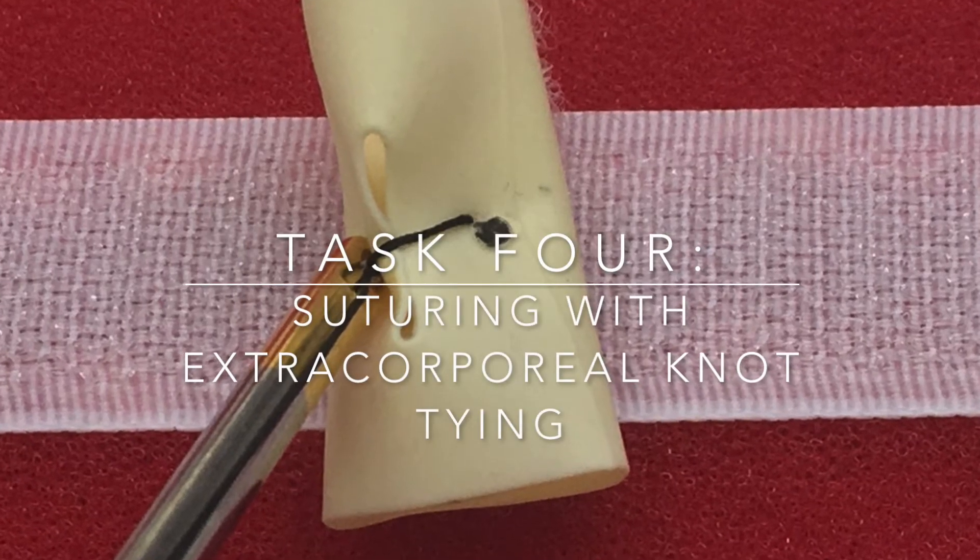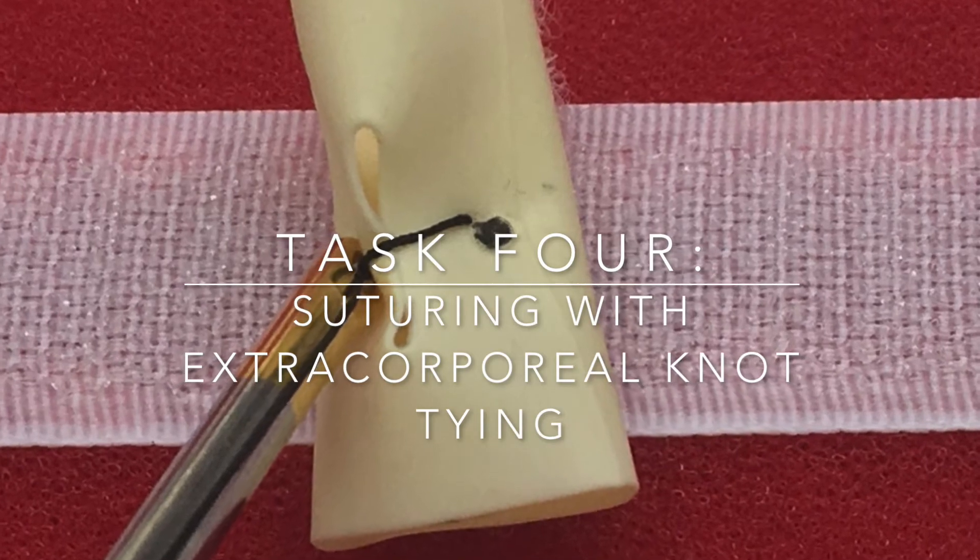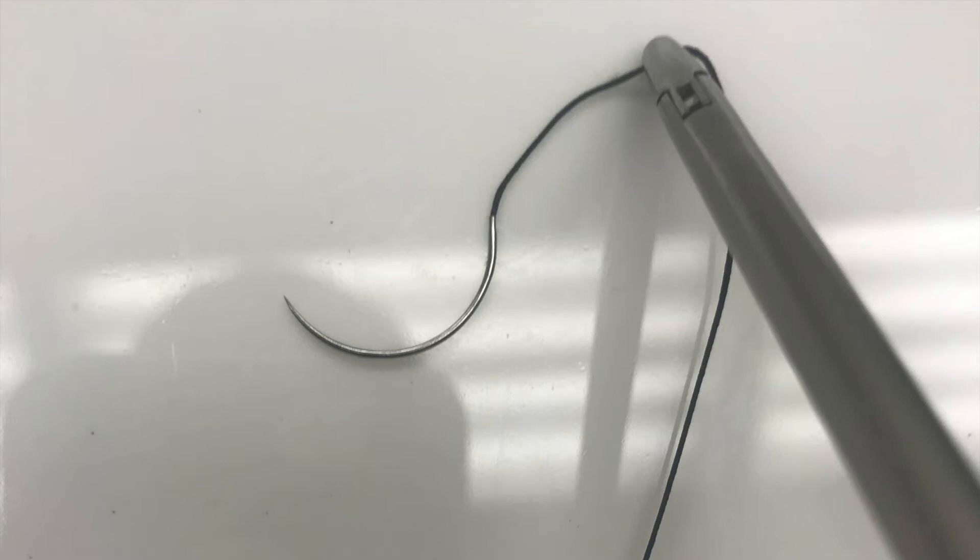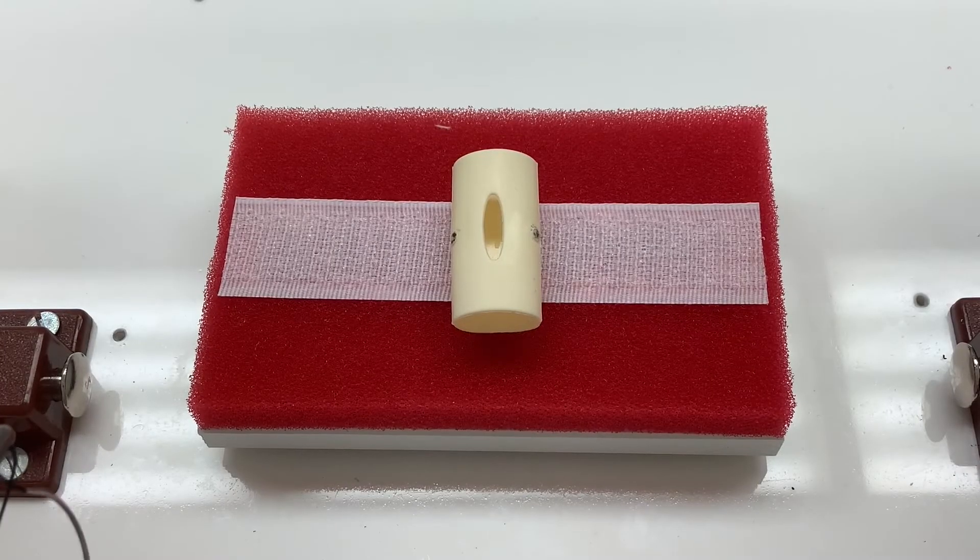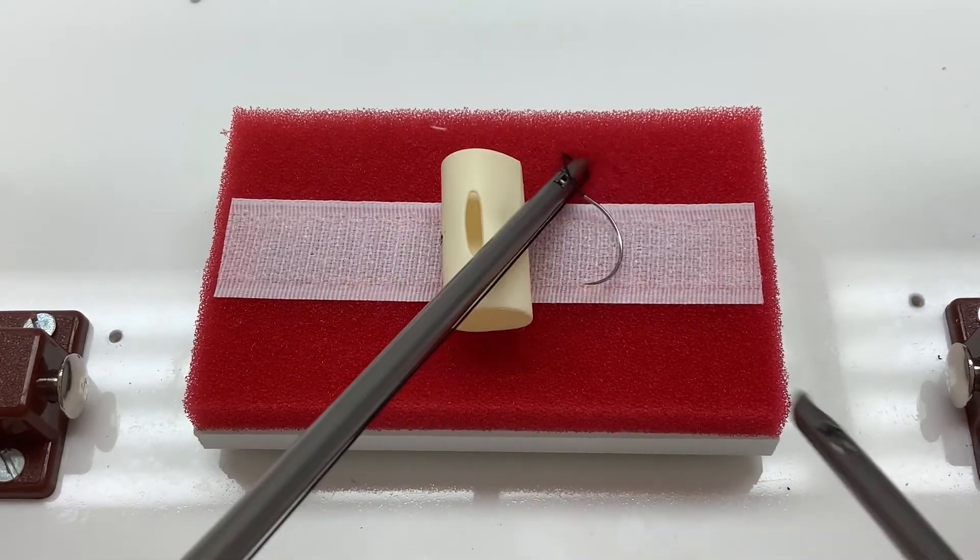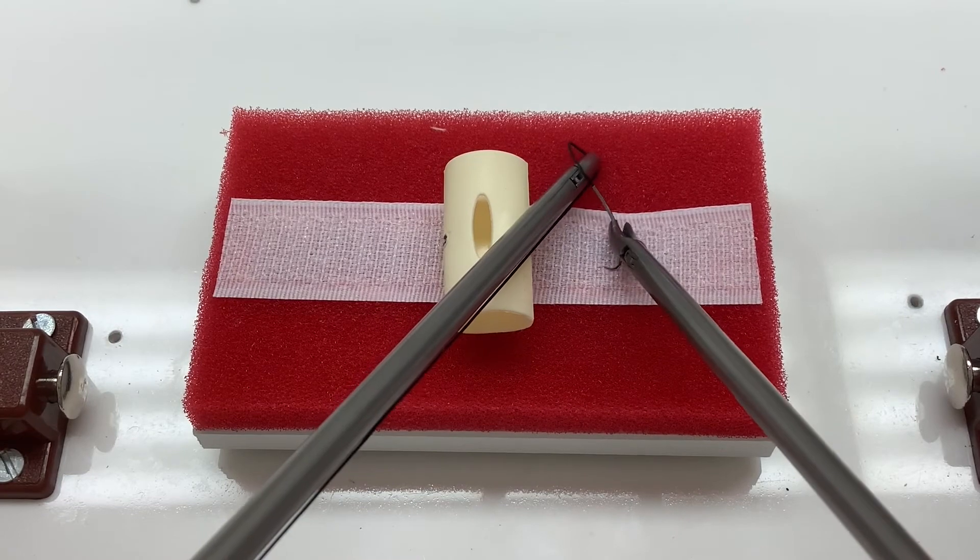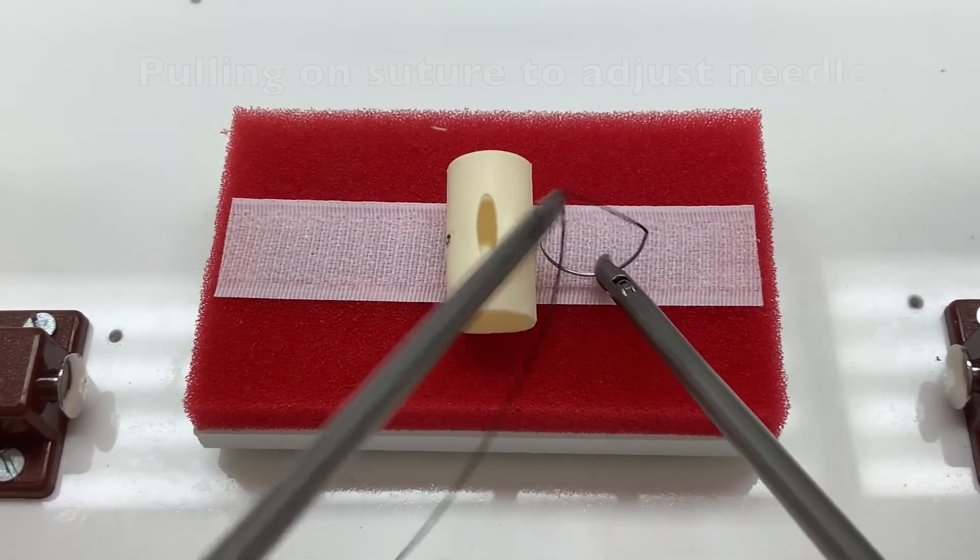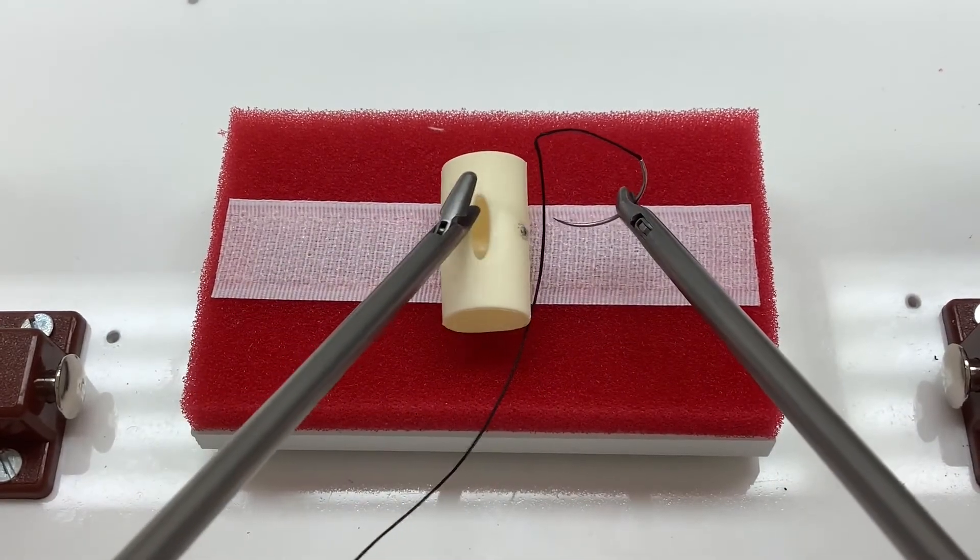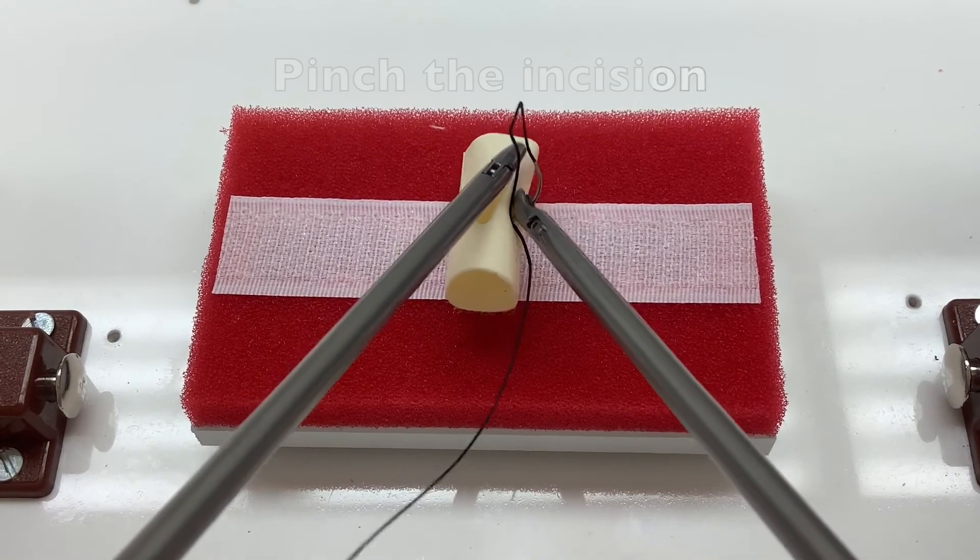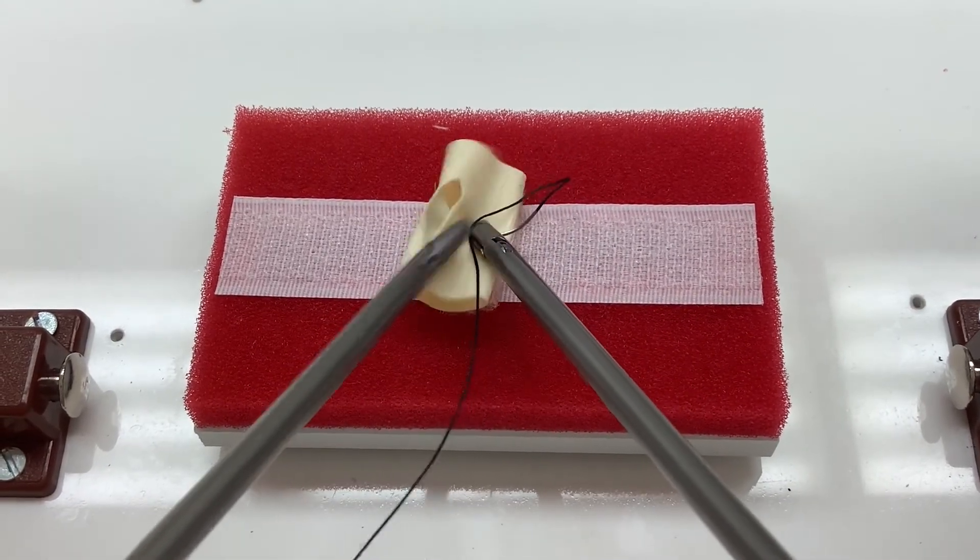Task 4, Suturing with Extracorporeal Knot Tying. Next, we pinch the top of the incision to approximate the markings. This makes it easier to go through both targets in one motion.